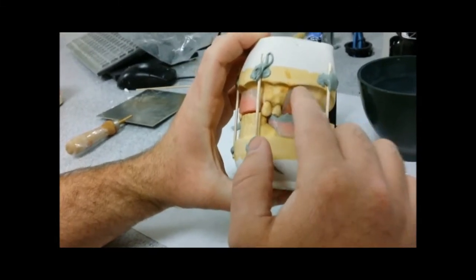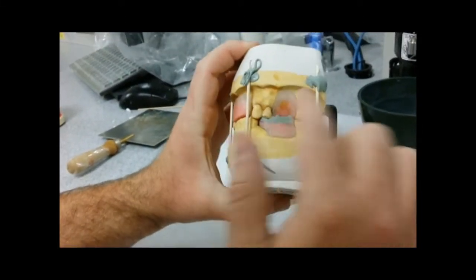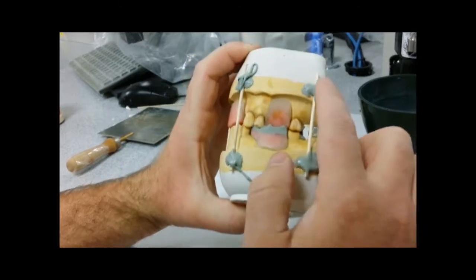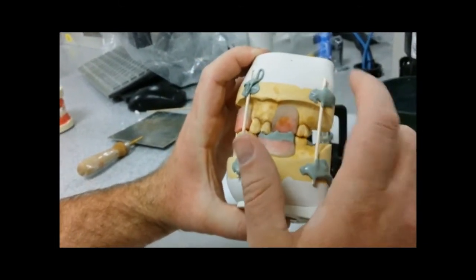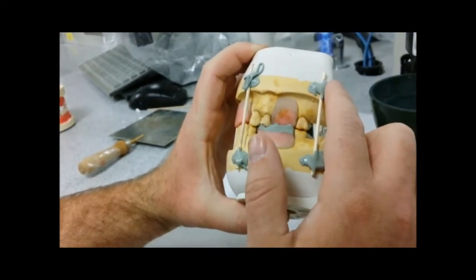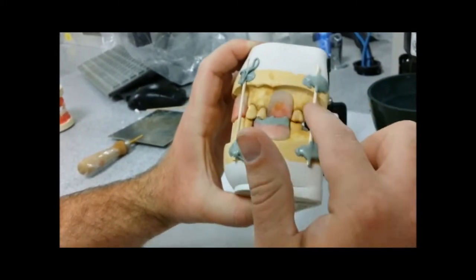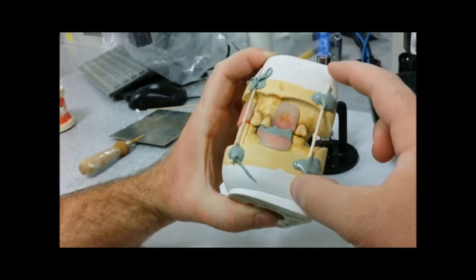You need to take your bite registration, your occlusion rim and you can either use a gray stick compound or sticky wax. Personally I prefer the gray stick compound. It's harder and I have a lot more problems with the sticky wax.